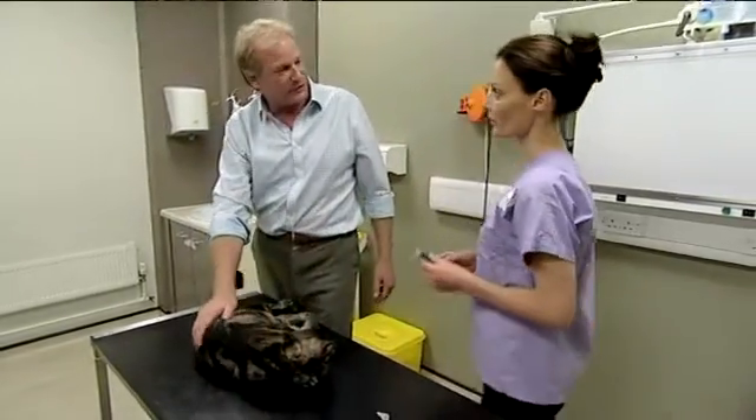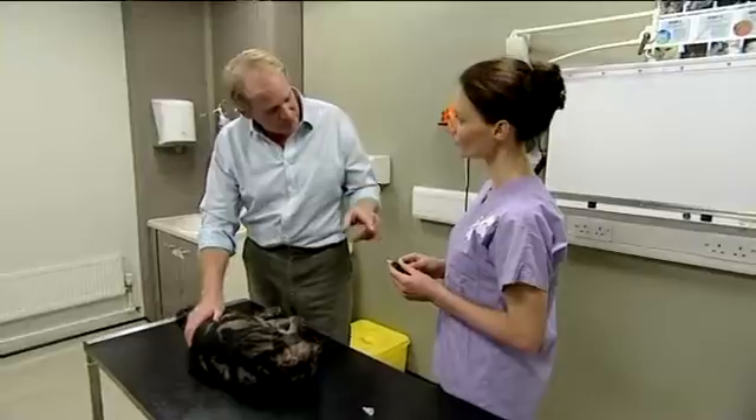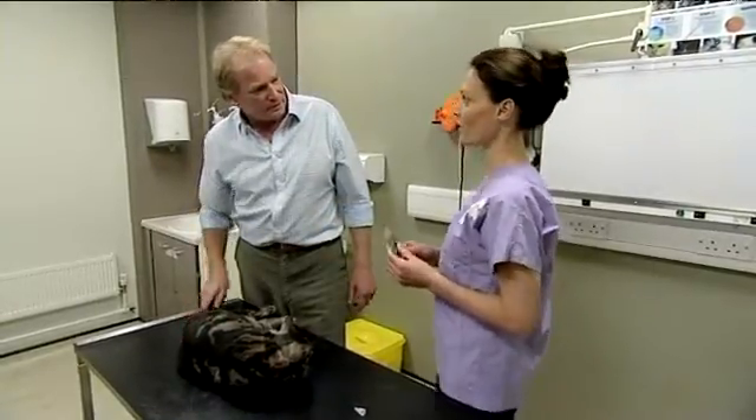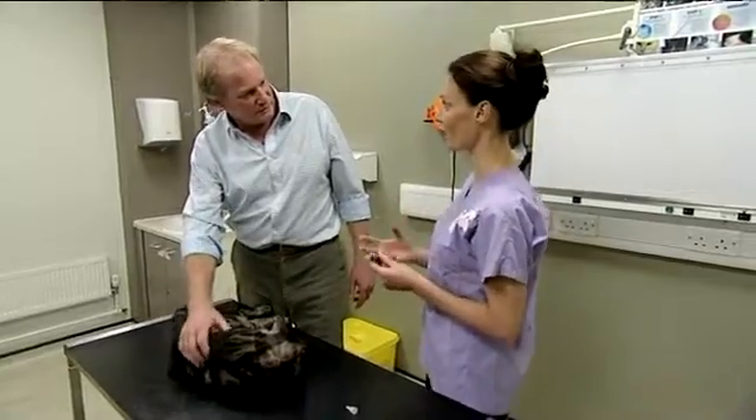And he didn't seem to mind that at all? It's a lot less painful than the conventional needle because the needles are very, very small in the vet pen. And presumably far more accurate as well. Yeah, absolutely. That's one of the biggest advantages of having a vet pen — the actual compliance issue and the ease of administration of the exact dose.